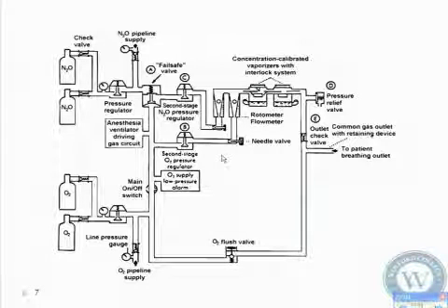It comes in, oxygen's going to push this diaphragm up, it's going to compress this valve, and that allows nitrous to flow out. Now, you don't see anything for air here, but on some of the diagrams, you'll actually see a third component here. You'll see air cylinders. And the reason they don't show that is because the only thing you're going to see is 1 pressure-reducing valve for that. Okay? So you're going to see a pressure-reducing valve, but you don't see a fail-safe valve because why do you think you don't have a fail-safe valve for air?